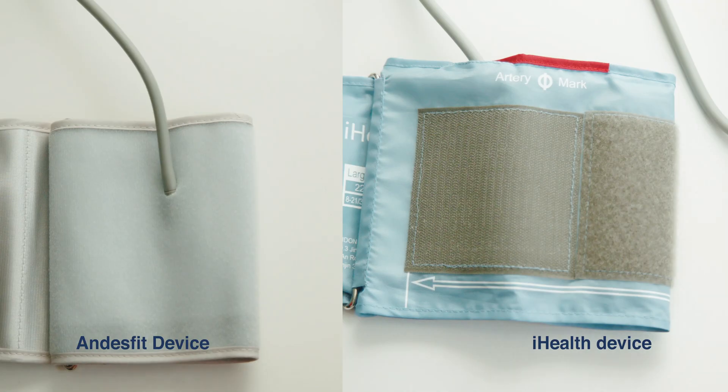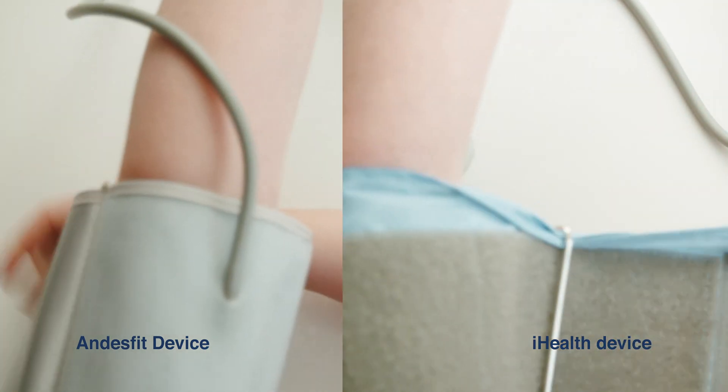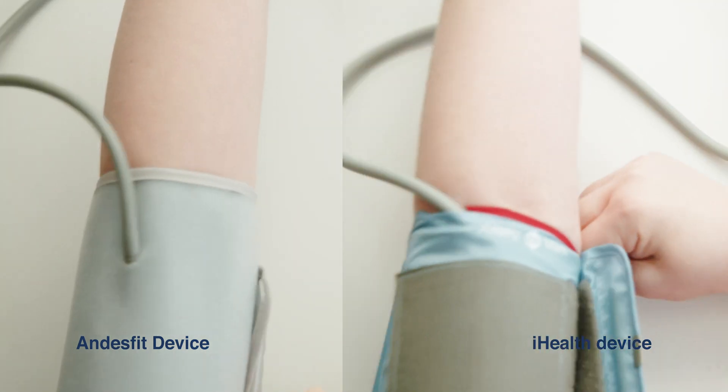Be sure to sit down at a table. Then wrap the blood pressure cuff around your upper left arm with the Velcro on the outside and the tube on the inside of your arm.